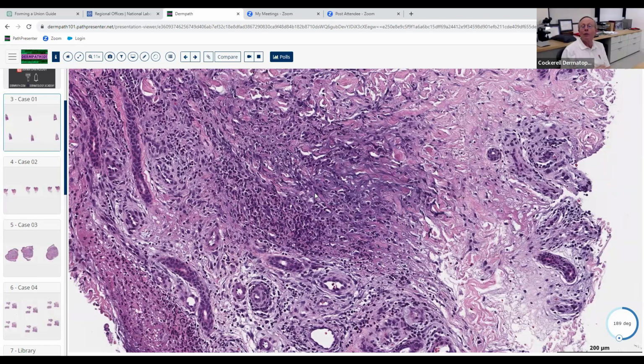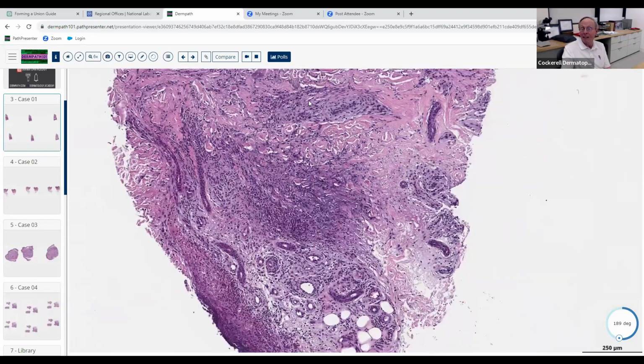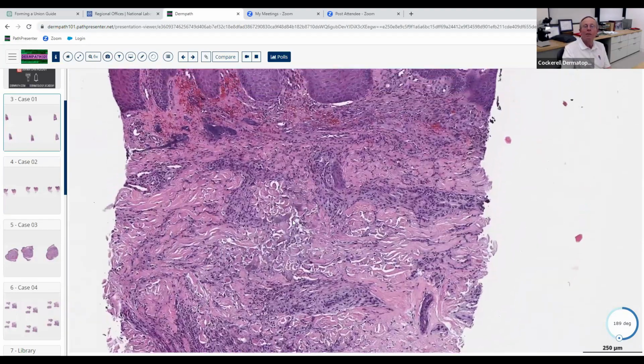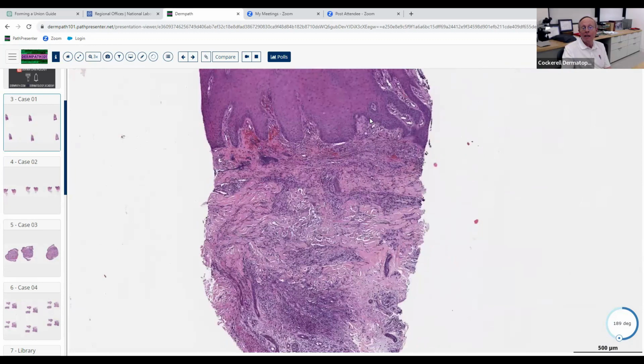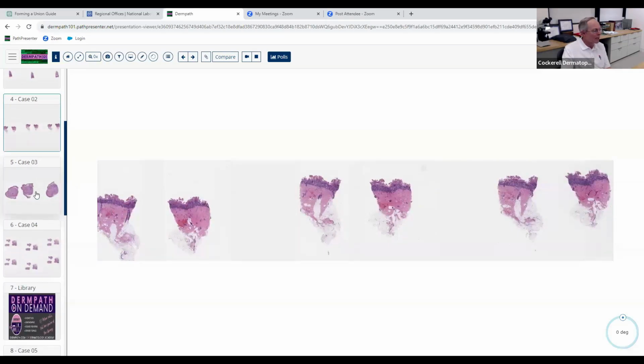So whenever you see abundant neutrophils, like for example, pyoderma gangrenosum or often Sweet's or this condition, we'll generally do a PAS and Fite, maybe the clinician cultures it just to make 100% sure that it's not an infectious disease, because neutrophils can be associated with that. In this case, it was negative, so there wasn't any infectious agent. It's a great example of this case. We don't see it very frequently, but it's a good case. They might possibly show you something like that on the board examination.